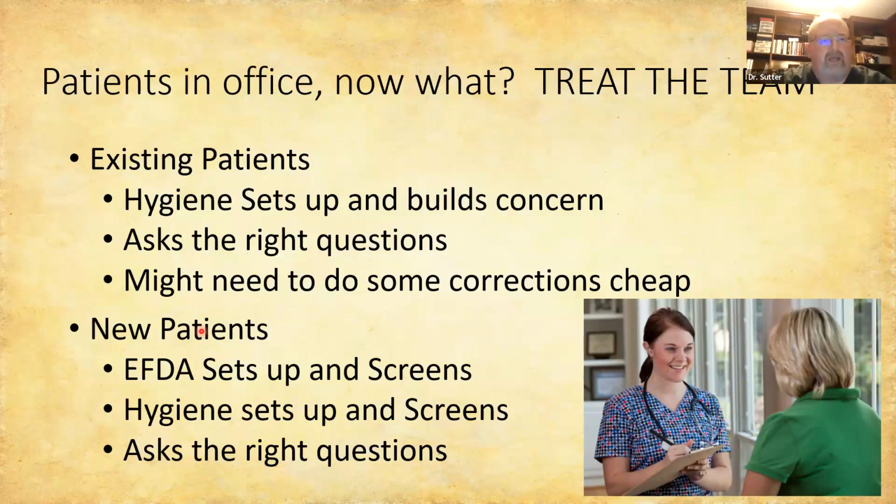So then what? As new patients are coming in, it took me a while in my own journey to get comfortable with the technology to a point where it's just expected. And so when a new patient comes in, the conversation goes something like this: Mrs. Jones, my responsibility to you is to tell you all of my concerns. So my hygienist is going to take some x-rays, we're going to do some periodontal probing, and we're going to check the bite.